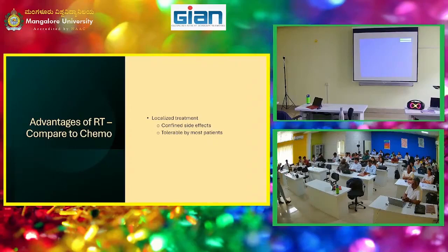We're not irradiating the entire body, because then it would be easy and you don't need AI, right? That'd be like sunbathing. You're irradiating your entire body on the beach, right? So there's no targeted anything. But in our case, for what we want to do, we want to target exactly where the cancer is.